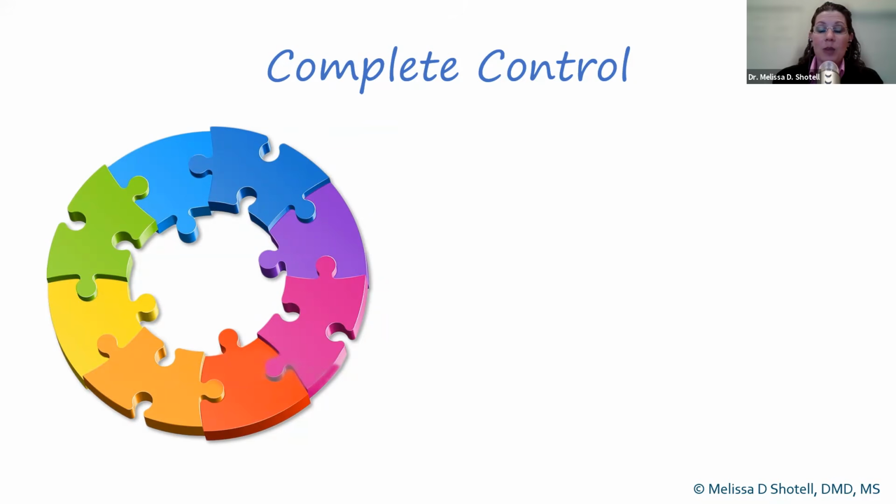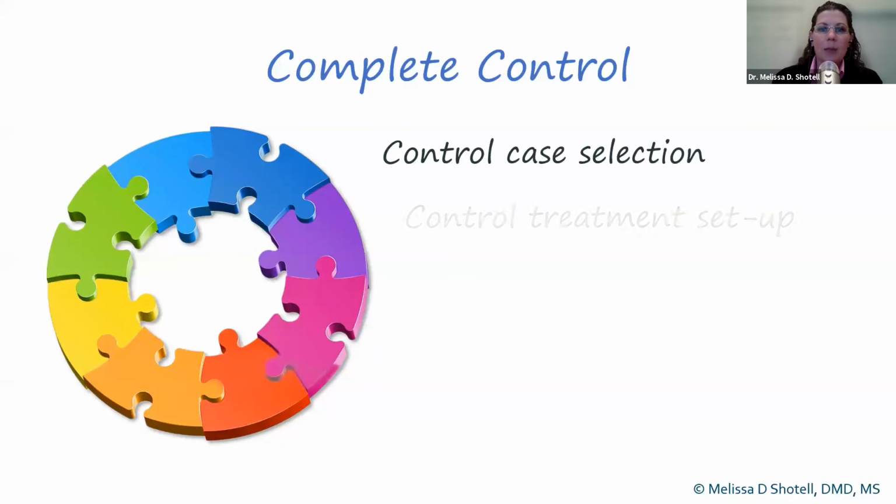So my movement towards in-office clear aligners in my practice began for the desire to have complete control of the entire process. I wanted control to begin with my case selection and selecting those patients that would be a good candidate for clear aligners and for in-office fabricated aligners. I wanted to be able to control my treatment setup so that I would have to create only one setup and not communicate back and forth with a technician.